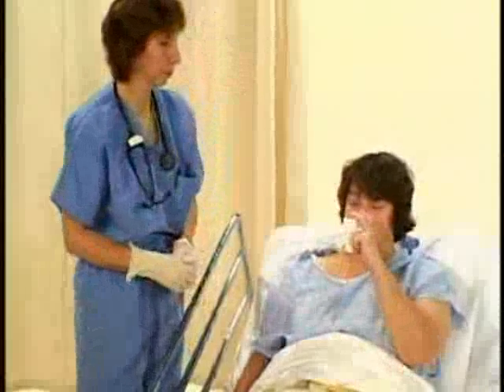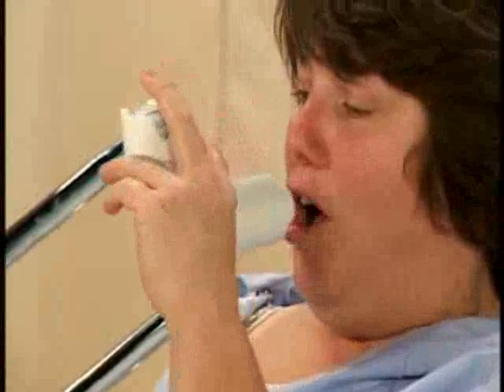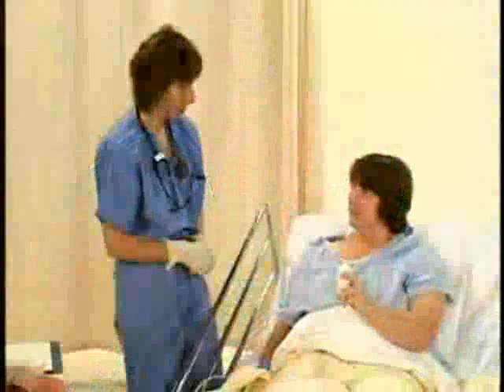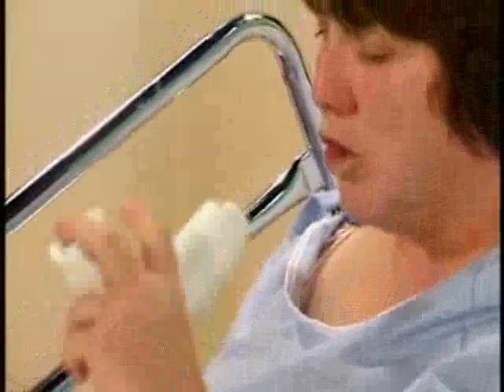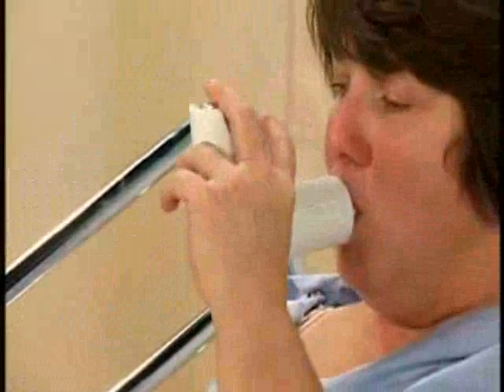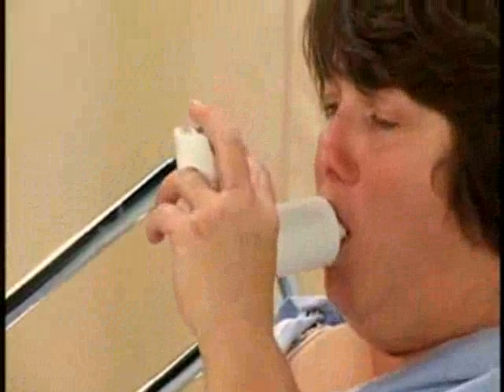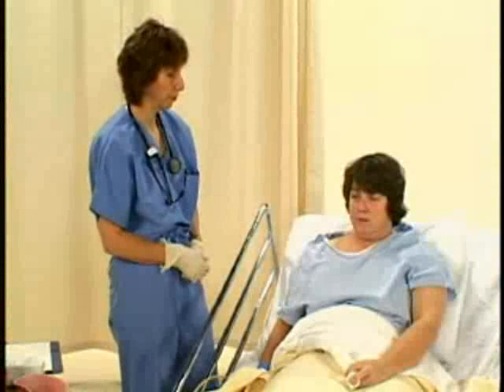Next, have the client place the mouthpiece in his or her mouth and close the lips tightly around the mouthpiece. Instruct the client to press down firmly and steadily on the metered canister to dispense the medication into the chamber while simultaneously breathing in slowly and deeply to inhale the medication. Have the client try to hold the breath for 10 seconds if able, then remove the inhaler to slowly exhale.